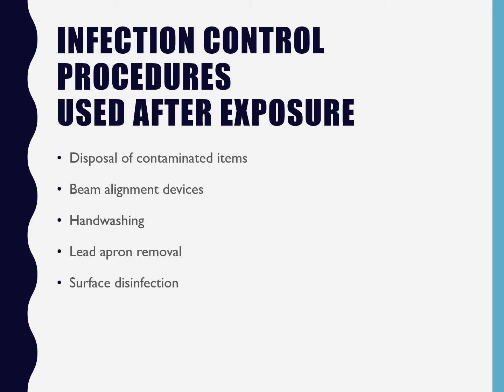And then, for the sensors. So for film, you'll have your things in a cup and you'll leave those while you're cleaning the room. And then you'll take that film over to the daylight loader. You'll put it in there. You'll put a new cup in there. We'll talk about that in a bit.